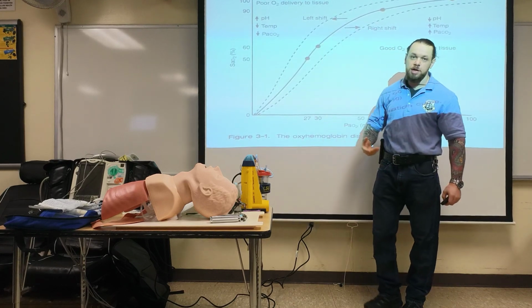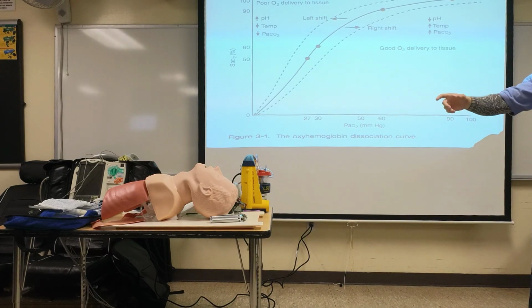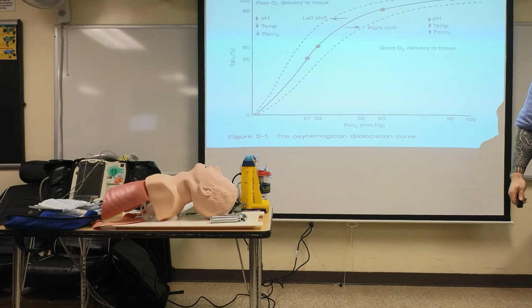So now you understand. What's the corrective action you'll tell them? Slow down. I want to see end-tidal CO2 there, 35 to 45, one breath every 5 to 6 seconds, probably toward the 6-second mark. I personally, when I'm about to intubate, do the ventilation myself. I let them squeeze the bag, but the motion of airway maintenance, I do it. The skill is the mask. The bagging is not the skill.